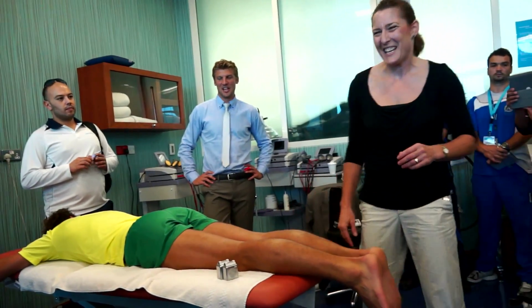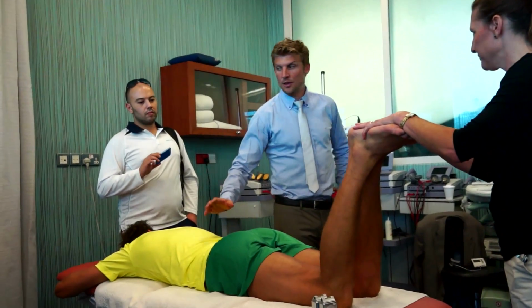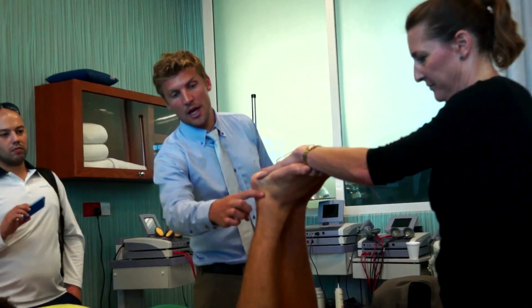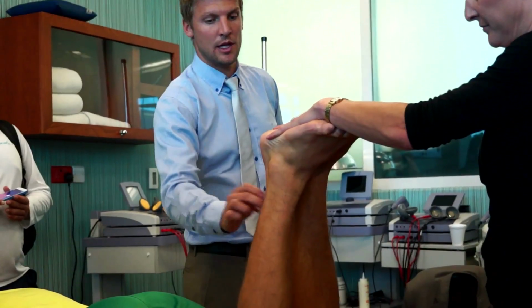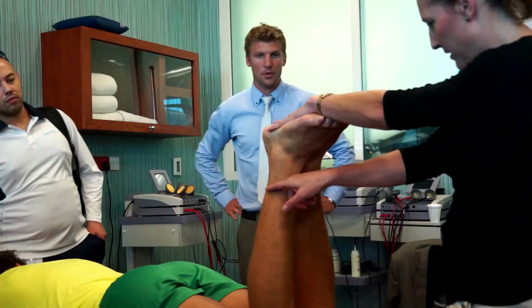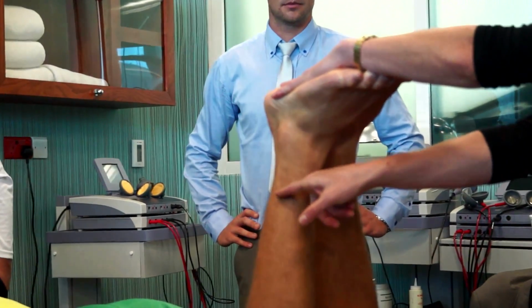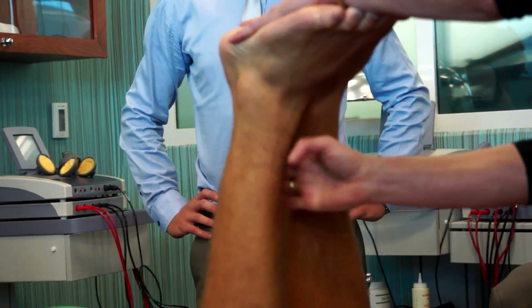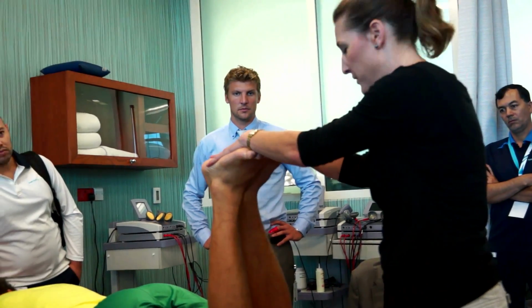unless you're a particularly good footballer that does his flip kicks in 90 degrees. So when we're starting the measurements, we're always starting with marking up the patients, and one of the marks that we use is a mark 8 centimeters proximal to the most prominent point of the lateral malleolus and around here. We used a permanent marker from the lateral side all the way around to the medial side, and so we had a nice reproducible point on the medial aspect of the tibia.